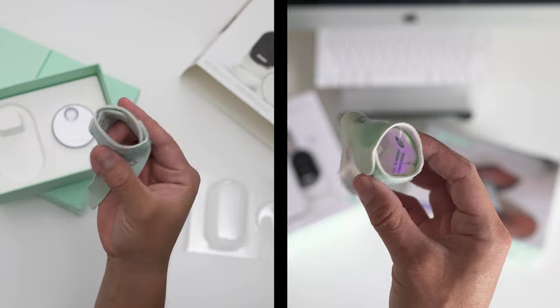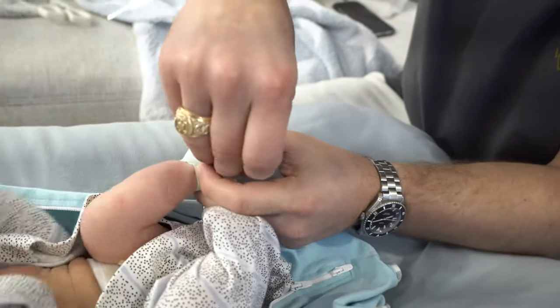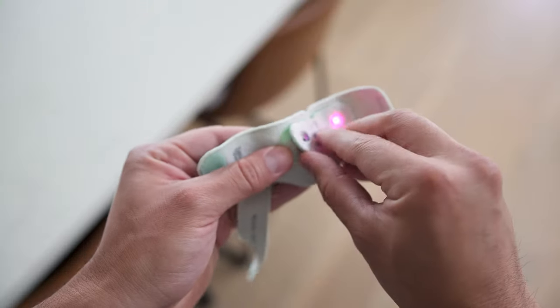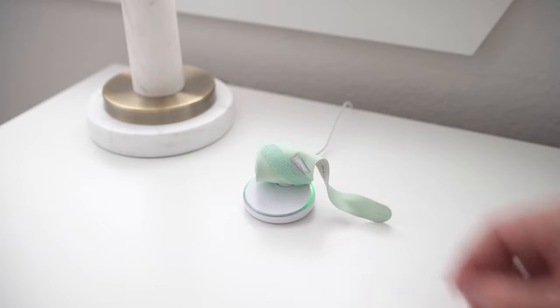So what are the differences? On the surface, the Dream Sock looks exactly the same as the third generation of the Smart Sock. It mimics the dual Velcro design with one strap looping around the ankle and securing itself on the other side to keep a tight fit. The sensor is also Velcroed on and can easily be removed and charged in the base station, which also looks exactly the same. But where it differs is the Smart Sock had features notifying users based on heart rate and oxygen levels that fall outside of preset values — the Dream Sock no longer sends notifications based on that.